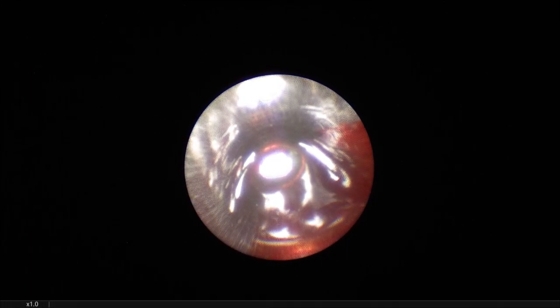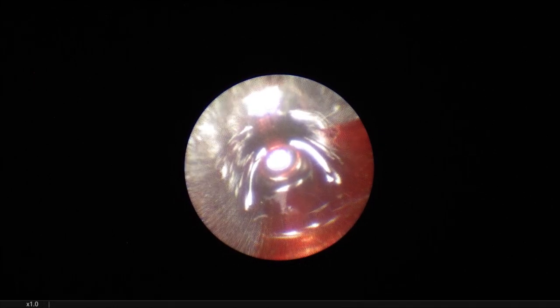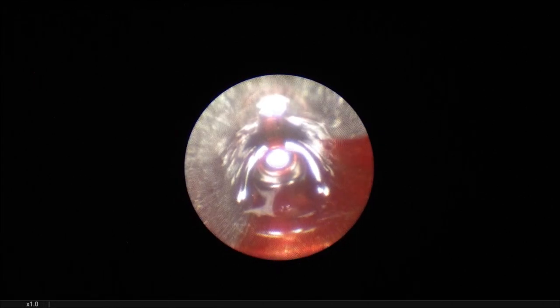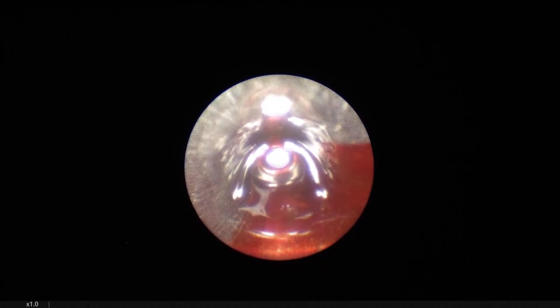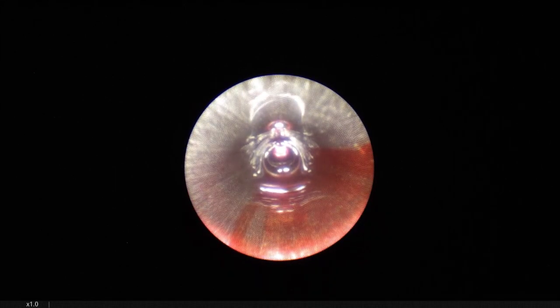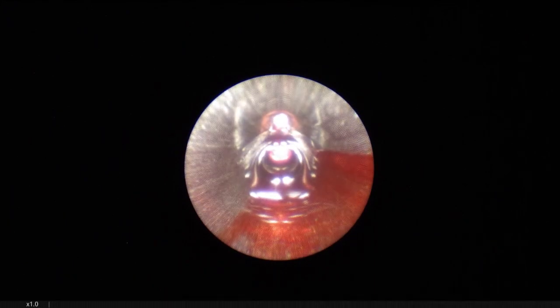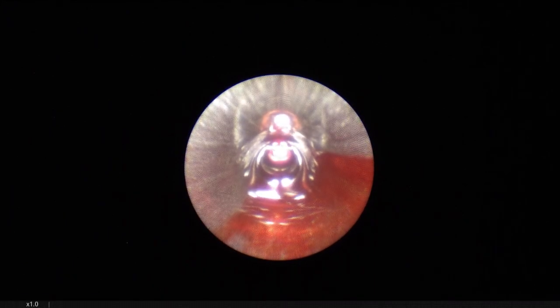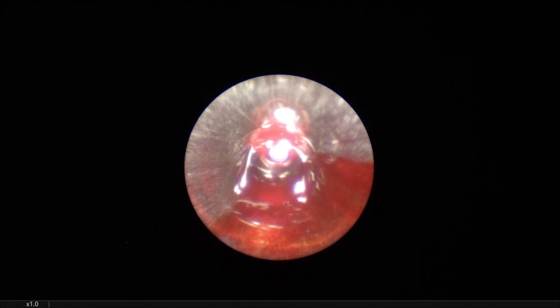No, it is very small, the working channel. So you are installing a nephrostomy tube? Yes. Through the lower or the upper puncture? Lower. Or both? The lower. Ah, the lower. Yeah. Yes. Okay, X-ray. X-ray.